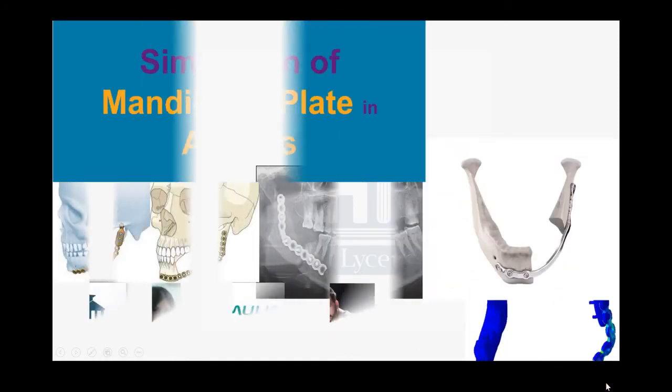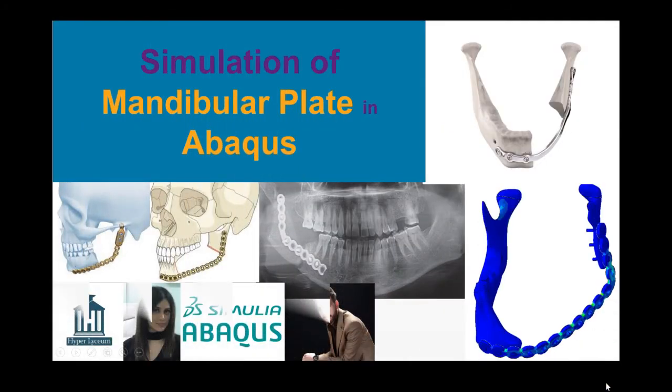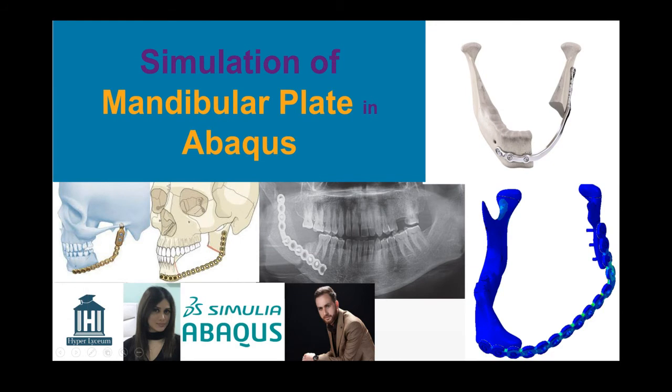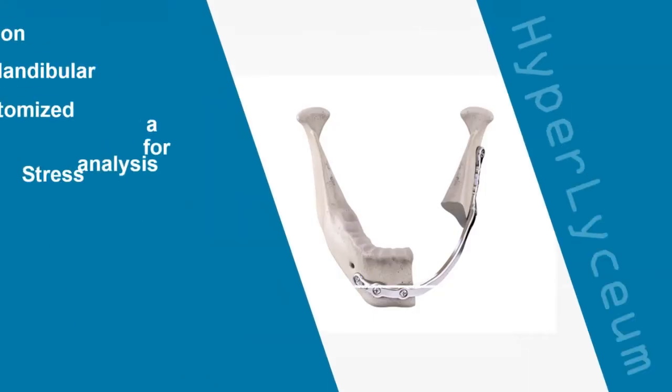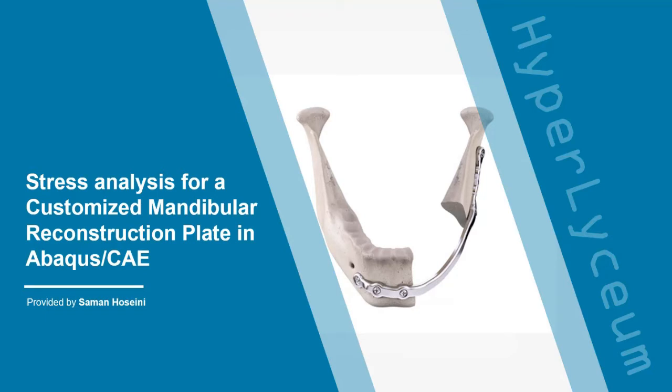This video was made by Saman Hussaini and narrated by Niloufar Eskandari from Hyperlyceum team. In this tutorial, I'm going to show you stress analysis for a customized mandibular reconstruction plate in Abacus CAE. So stay tuned!